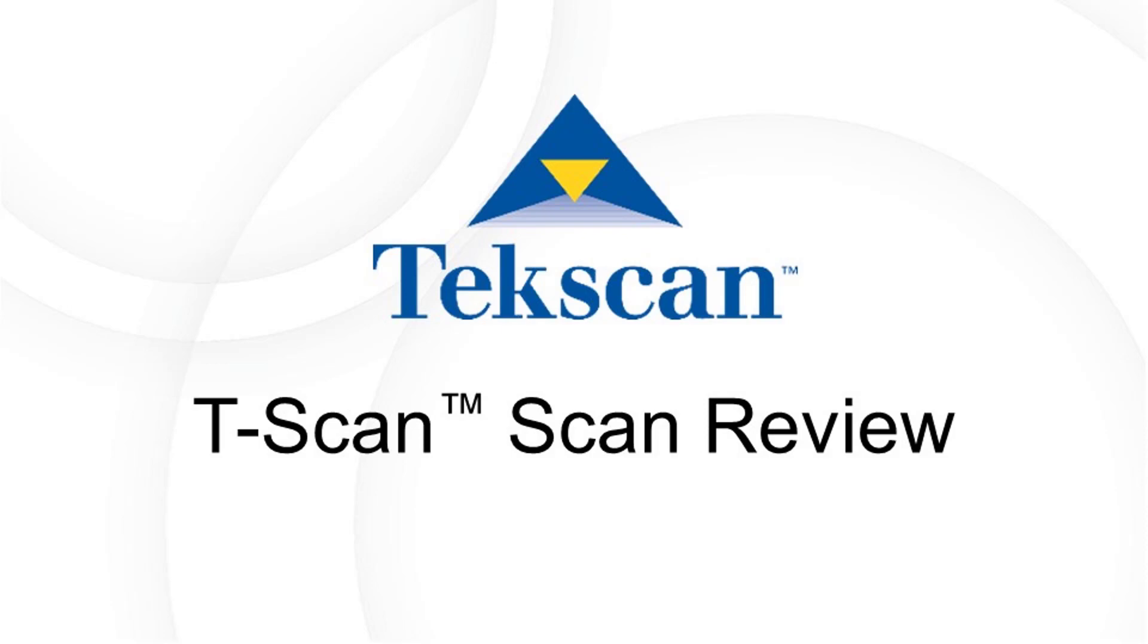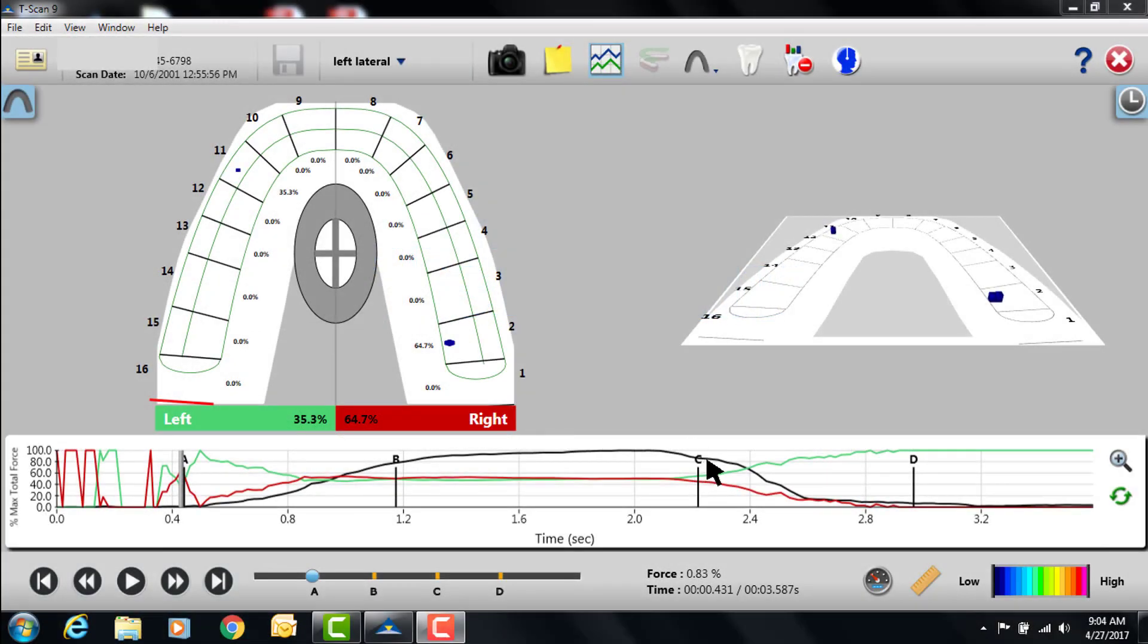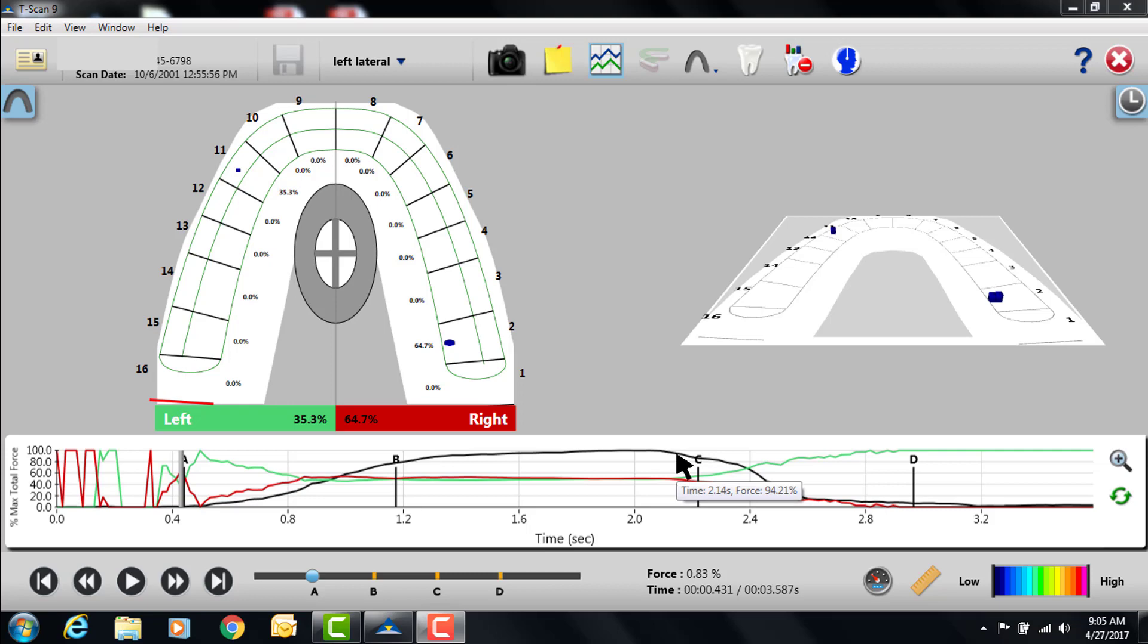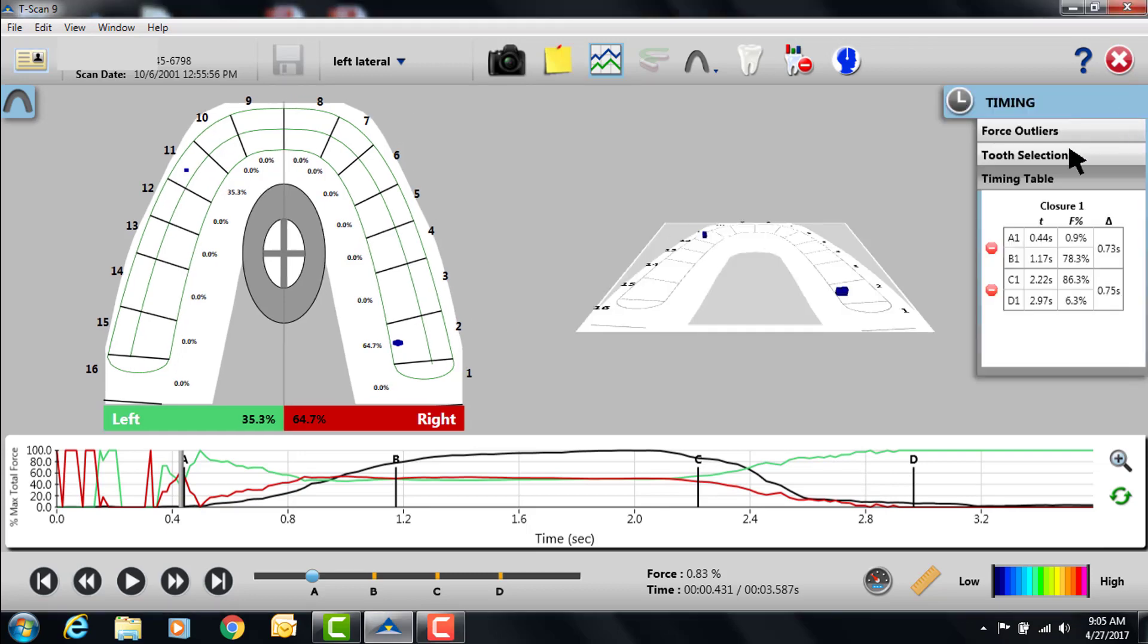Now, the reason we want to do this is there's some information that suggests that when a person has a long disclusion time, meaning from the movement's origin, which would be located at C, which is the beginning of the patient moving in this case a left lateral into a left lateral excursion, the time between the origin and the completion of the excursion should be short, and actually it should be less than 0.49 seconds.